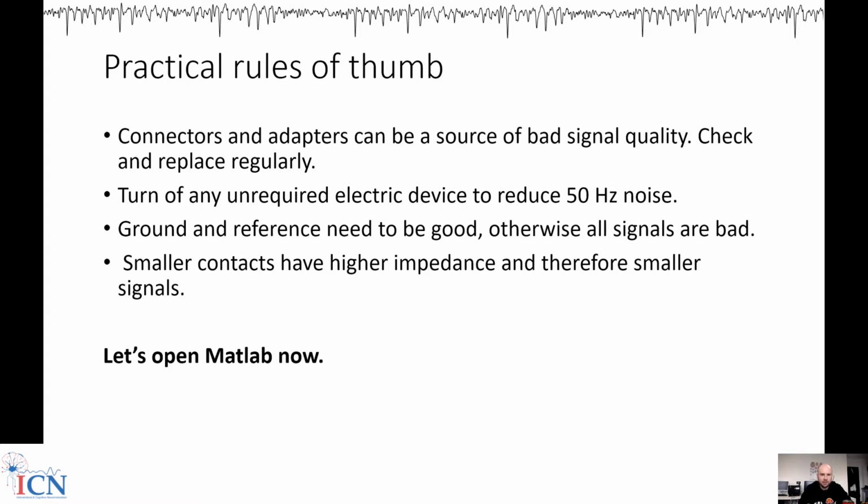So we decided for this because we didn't want to lose basically one channel, and we have these directional contacts where it would also not be so clear how to re-reference. If you have all the same contacts, it's quite straightforward to think that you do all bipolar, but the re-reference or the starting referencing for the directional leads would be a bit different then. So I see the point of using one channel because it can save you a lot of hassle, but we decided for the other option basically in the MEG.